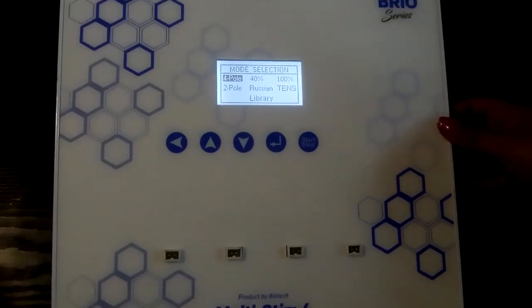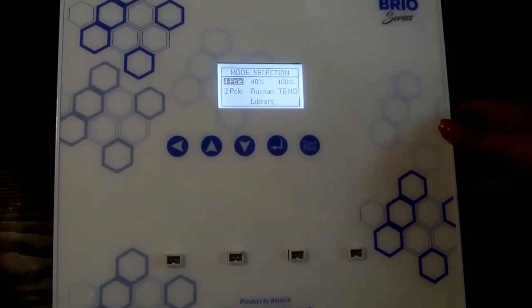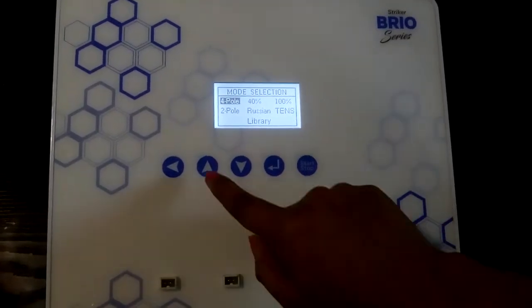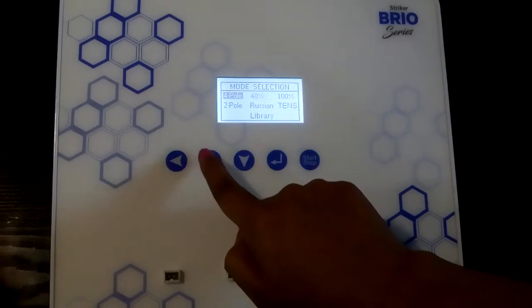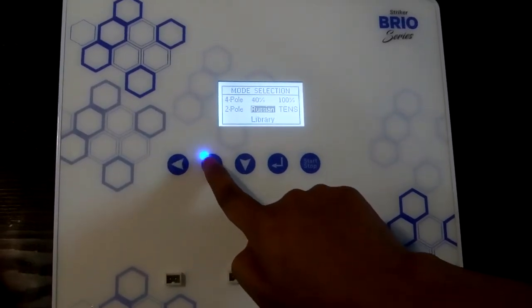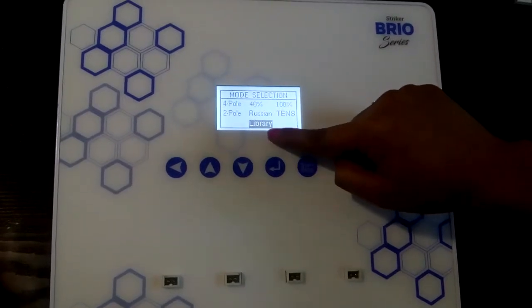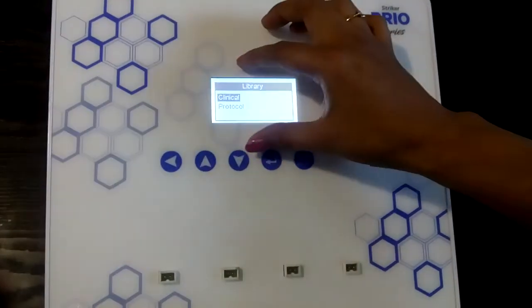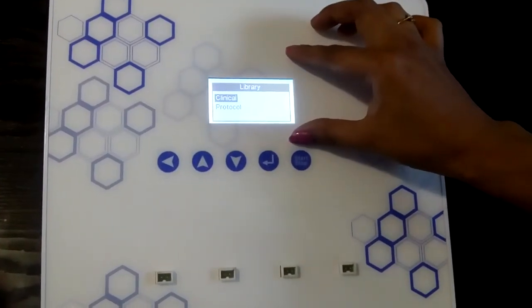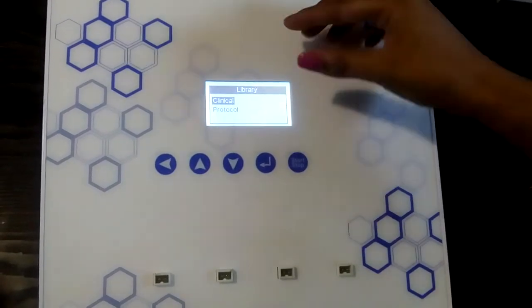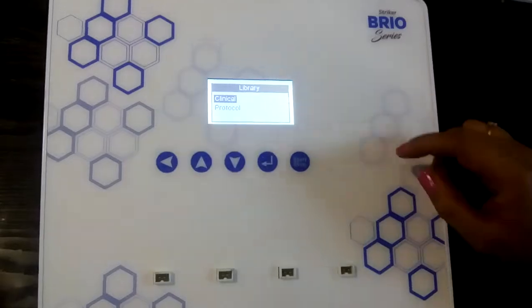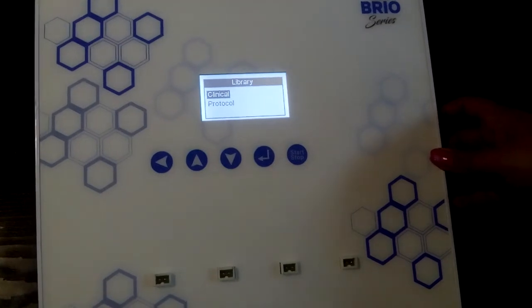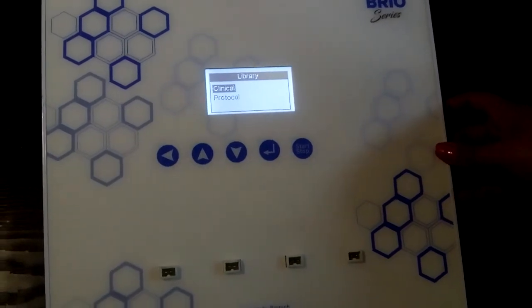Up till now we have seen how to increase the intensity of individual currents and set the parameters of a particular current. Now let us move on to the library. To go to the library, press the up button until library is highlighted, then press enter. The library screen is divided into 2 sections: the clinical library, which contains 19 predefined protocols, and the protocols section, which contains 26 user libraries.